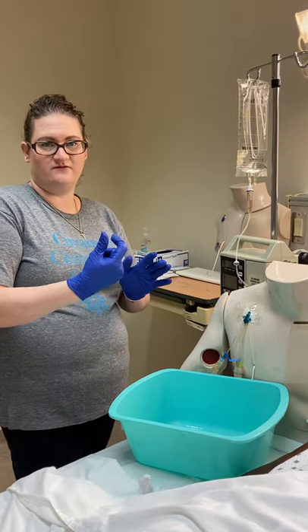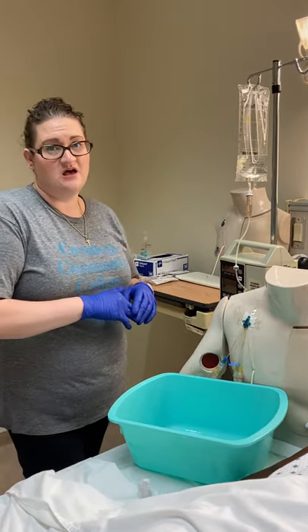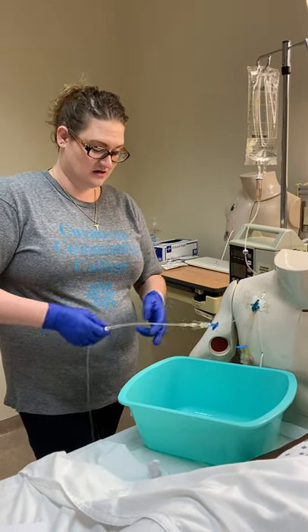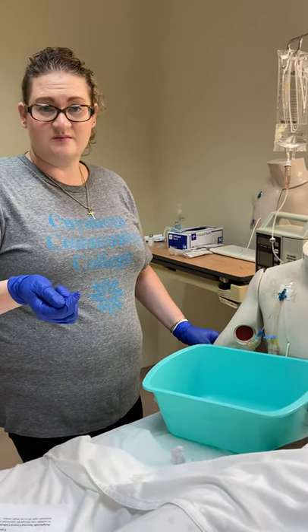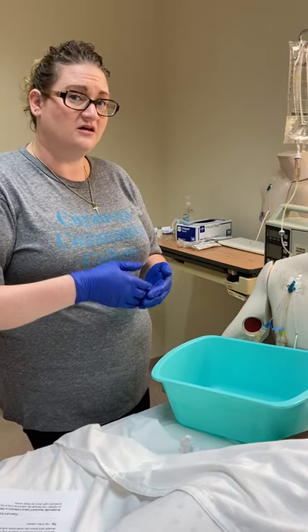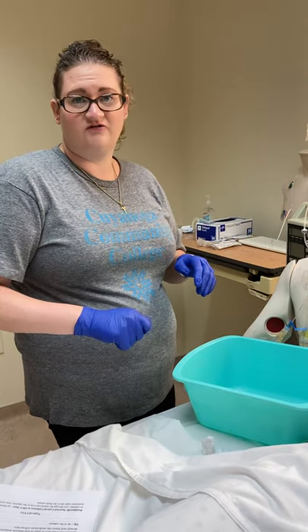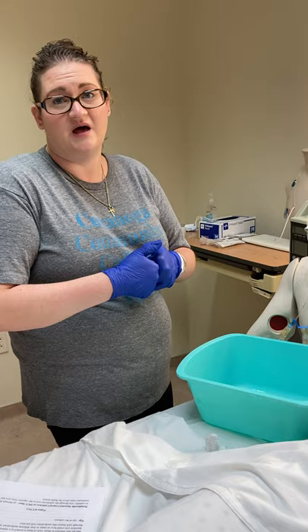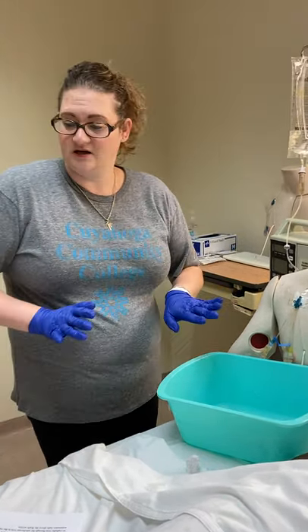You want to use 10 mL syringes on our central lines. The exception would be if you need to give a very small dose medication — you'd use a smaller syringe to get a very accurate dose, and that would be okay. But your flushes need to be 10 mLs before and 10 mLs after. Some facilities require a 20 mL flush after you give a med or draw blood.